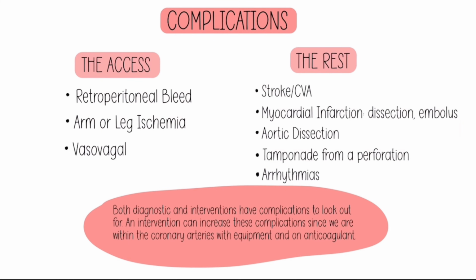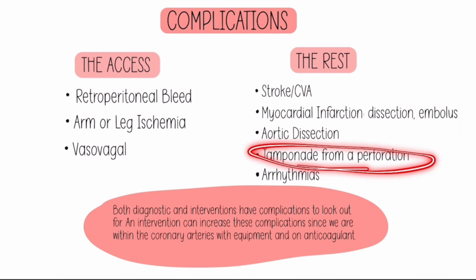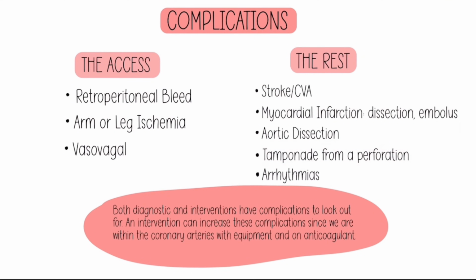So remember, both diagnostic procedures and interventions have complications to look out for. Interventions can definitely increase those complications because we are not just within the coronary arteries, but we're also anticoagulated. Thinner blood means you bleed faster if you do have an issue, so we want to be very, very careful there.